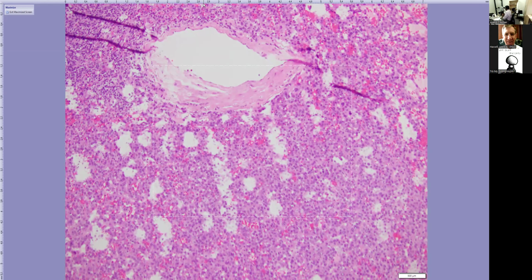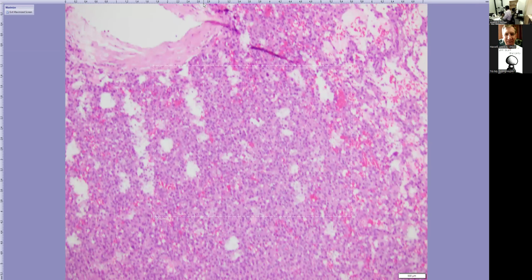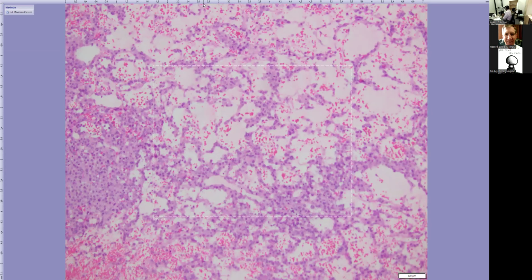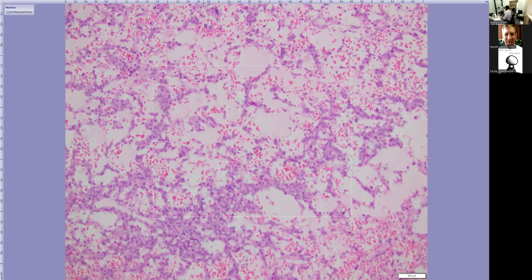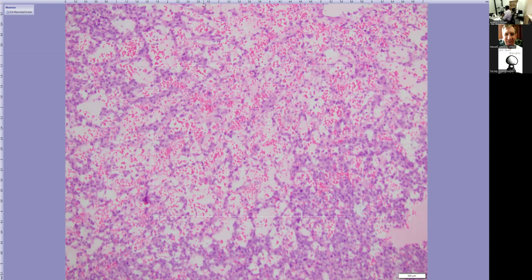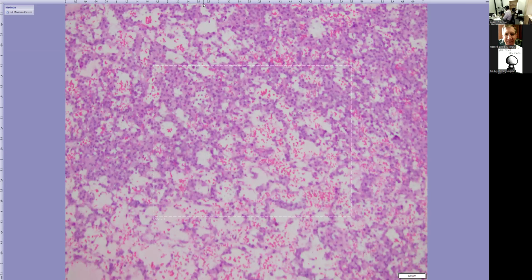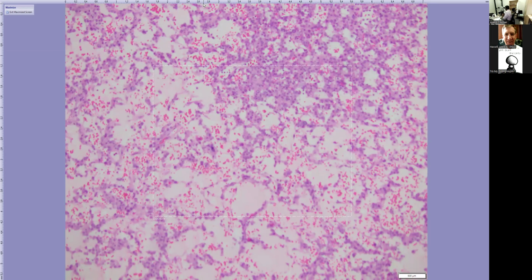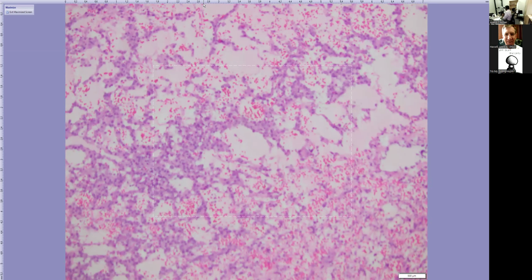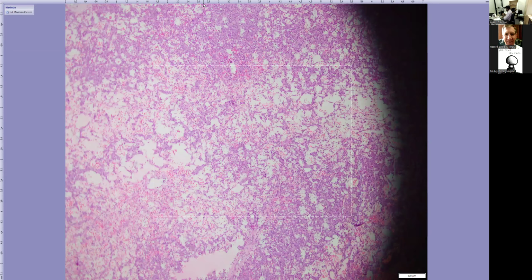And then I was thinking some kind of renal cell neoplasm with oncocytic changes. I was thinking of a vascular tumor, like an angiosarcoma. There was no history of any radiation this patient got for her breast cancer, and moreover, this is not in skin or dermis. This was in a kidney. So even though angiosarcoma was in my differential, it was not at the top. It was more towards the middle or towards the bottom of my differential. So I did a bunch of workup.